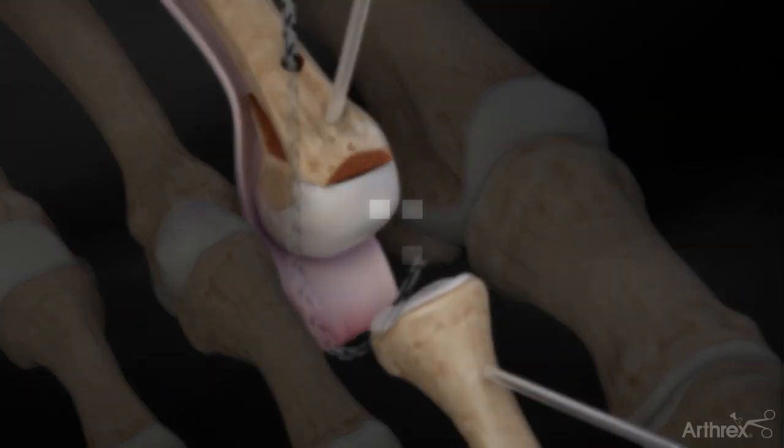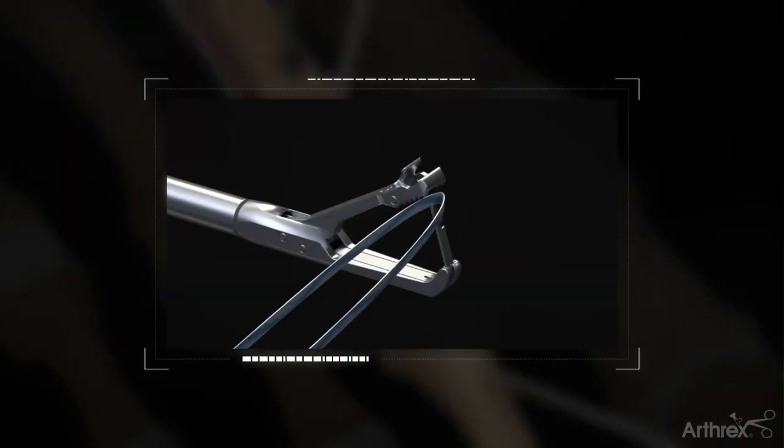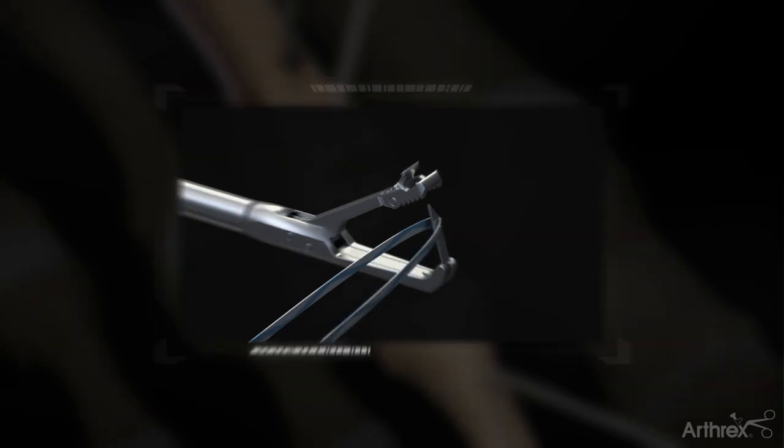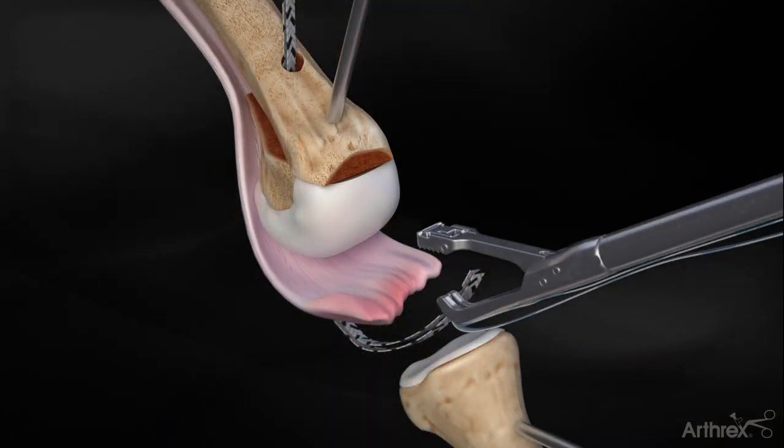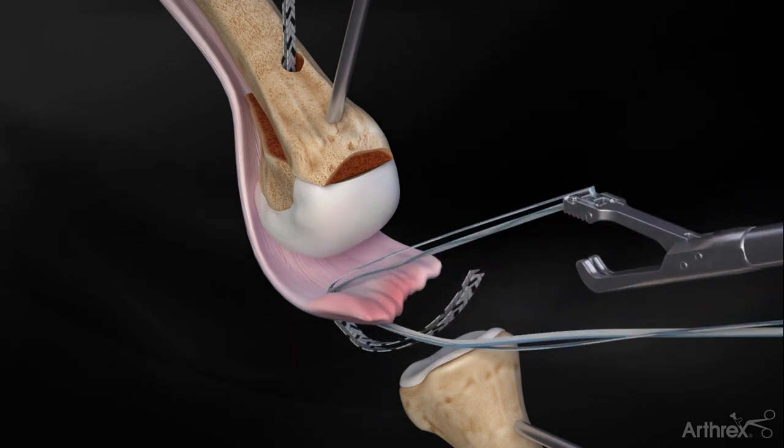When the plantar plate has been mobilized, load the Miniscorpion DX Suture Passer with a doubled-over suture tape. Grasp the plantar plate medially or laterally. Squeeze with the palm of your hand, advancing the needle and suture through the tissue.